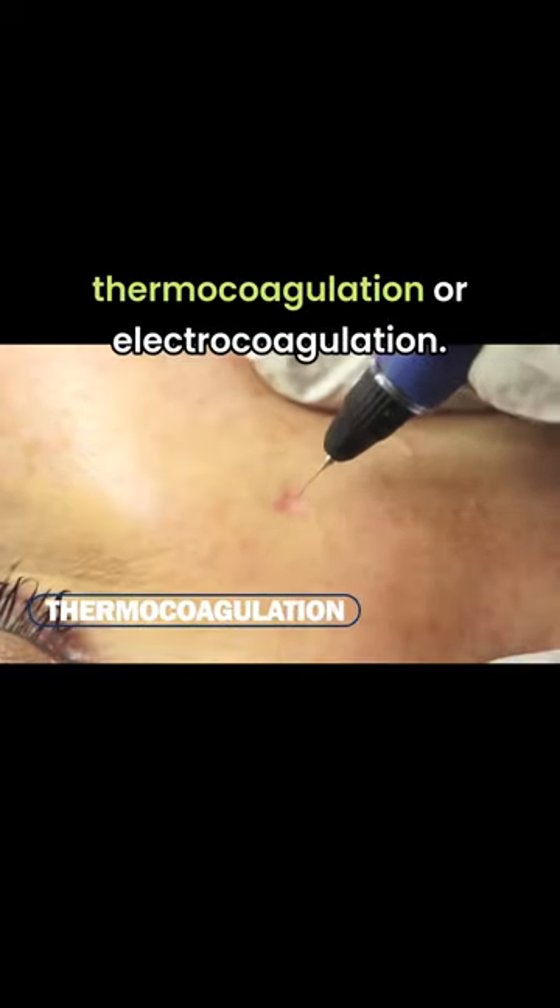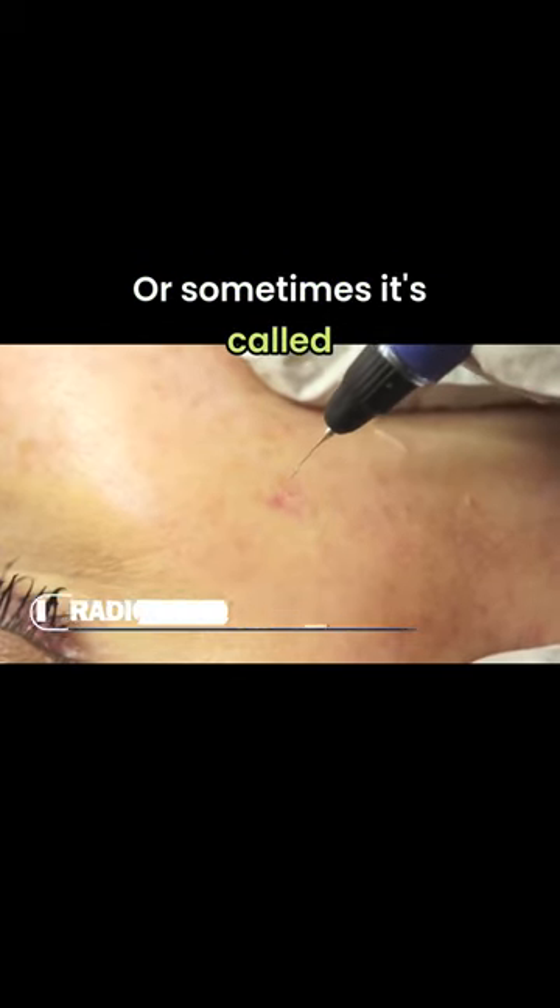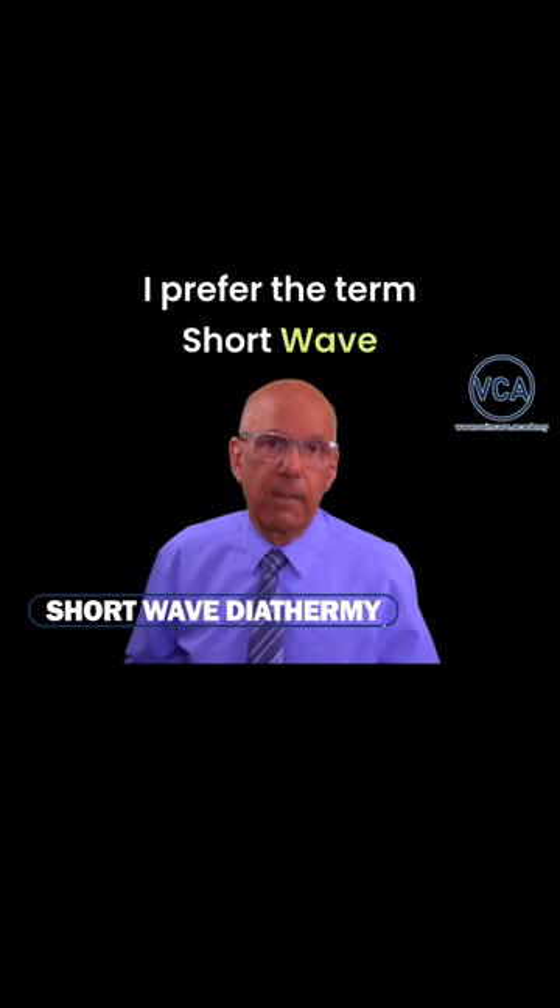Sometimes it's called thermocoagulation or electrocoagulation, or sometimes it's called radiofrequency ablation. I prefer the term shortwave diathermy.